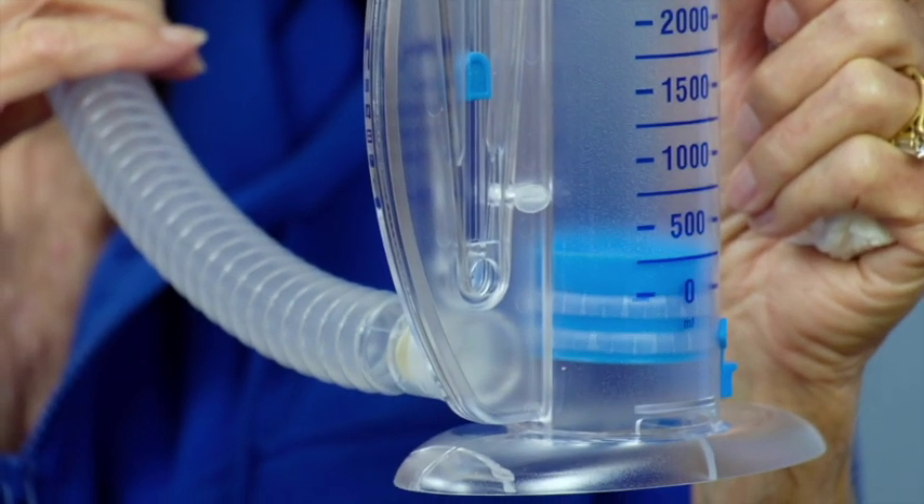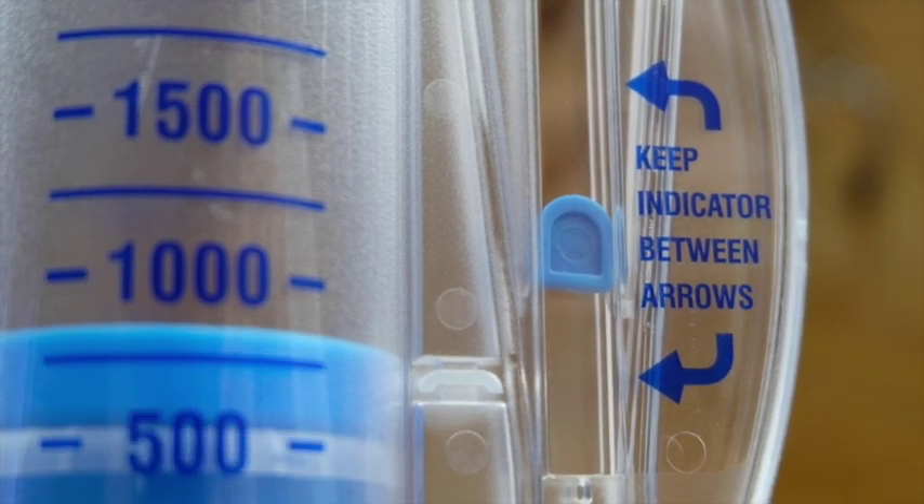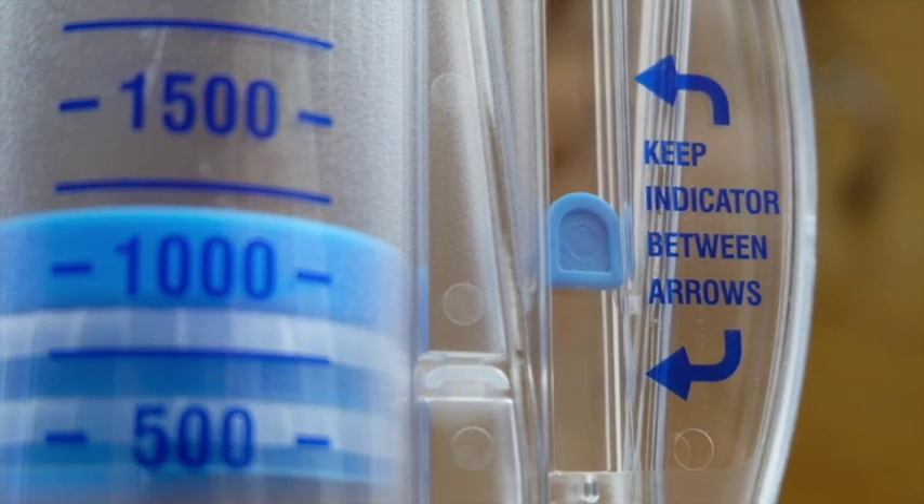Empty your lungs completely and then place the mouthpiece into your mouth. Breathe in as deeply as you can, keeping the blue flow meter within the two arrows. Hold your breath for 2-3 seconds.